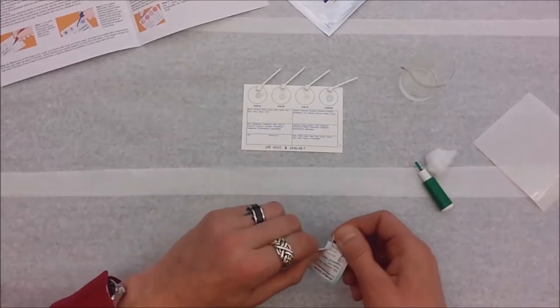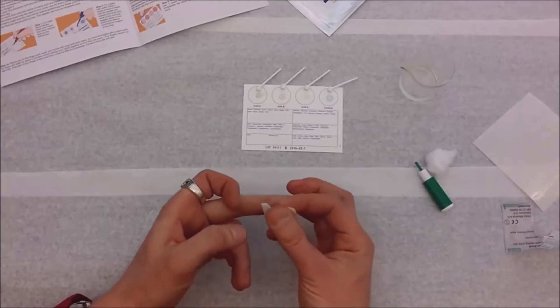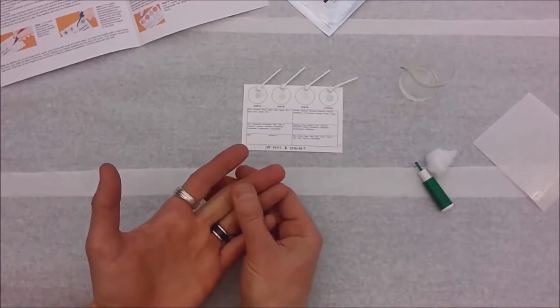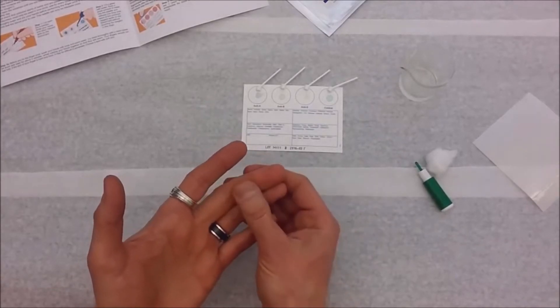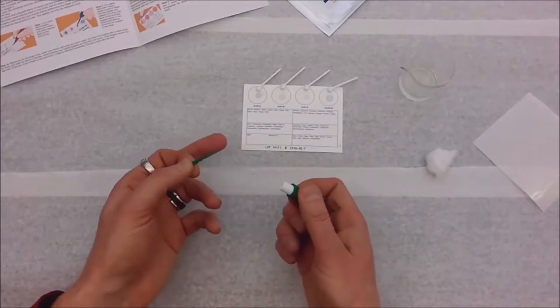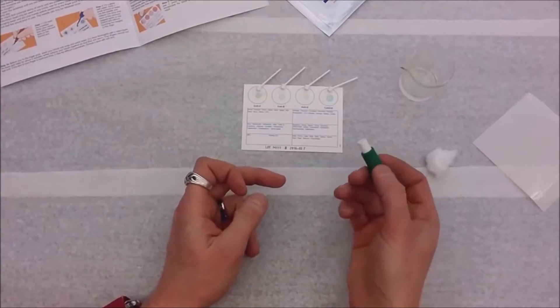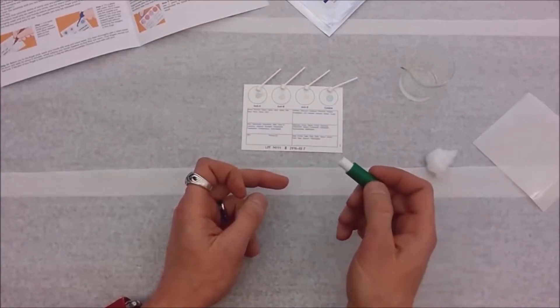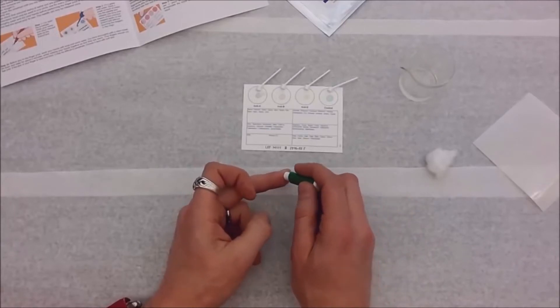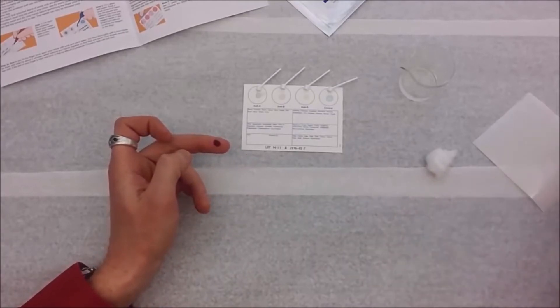I'm ready to poke my finger but first I have to clean it — a little alcohol pad to clean off the finger. I always pick my middle finger; I figure it's the one that swears, it deserves it. I'm going to dry off the alcohol a little bit. Make sure your hands are warm before you do this and make sure they're good and pink so you've got good blood down there. Here's the poker: twist that green thing inside until you can get it out, pull it out, and throw it away — the device is now ready to go. Warning: this poker is a one-shot deal; it will only poke you once so make sure you push hard and give yourself a good poke.